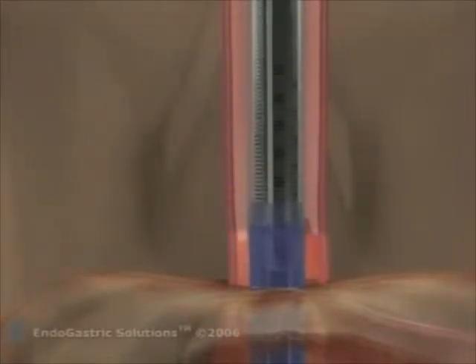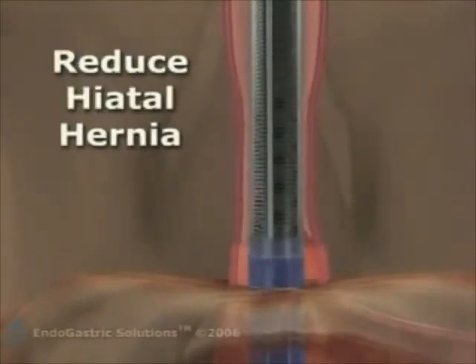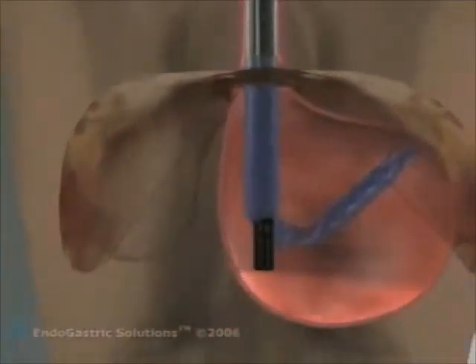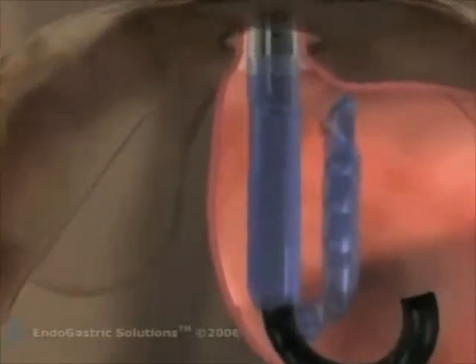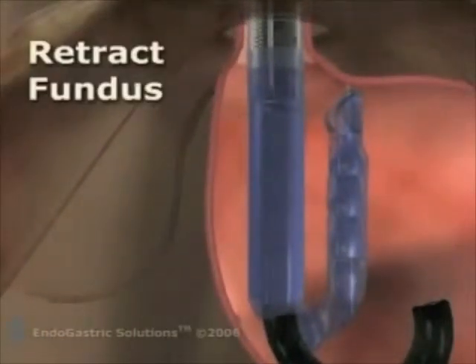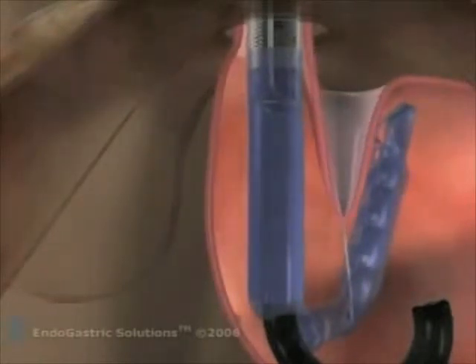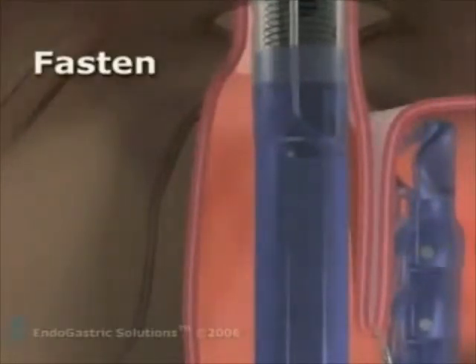Prior to starting the case, the esophagus is lengthened and positioned by engaging the invaginator and gently repositioning the Z-line at the level of the diaphragm. In the following step, a retractor pulls down a 3 to 5 cm flap of fundus and positions this tissue in the center of the device to begin the reconstruction of the valve.